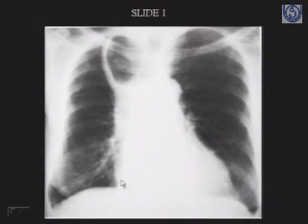For a right atrial pathology, what will happen? Can you comment on right atrial pathology on a frontal skiagram? In right atrial pathology, there are two signs which help us. First, there will be an increased distance of the right heart border from the midline of the spine. Second, the distance between the diaphragm and the superior vena cava will be more than the distance of the superior vena cava above that.